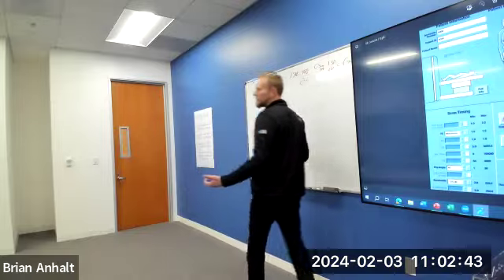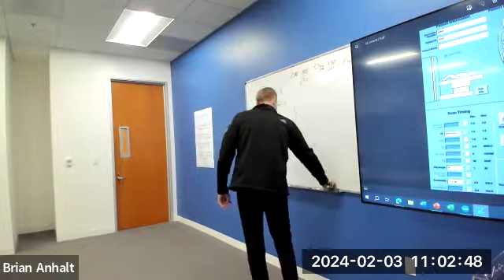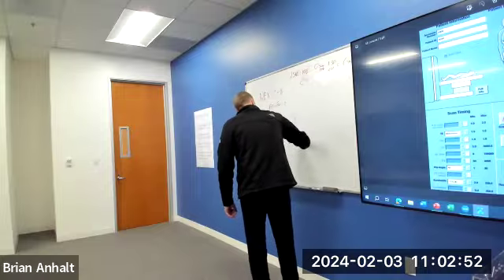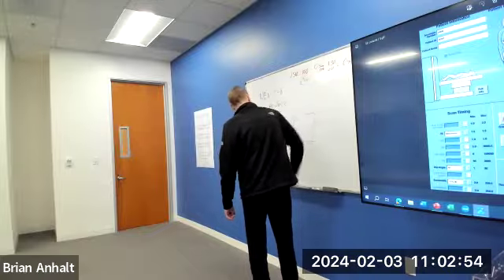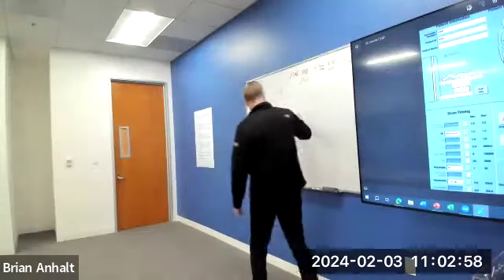I'm not just going to eat the whole thing. I might, but we probably just want to share it with people, right? We're going to cut it. Let's make it a square though. Because in MRI, that frequency field of view is square. We're going to cut it into multiple pieces in different directions, right? In 2 directions. We're going to slice it like this.